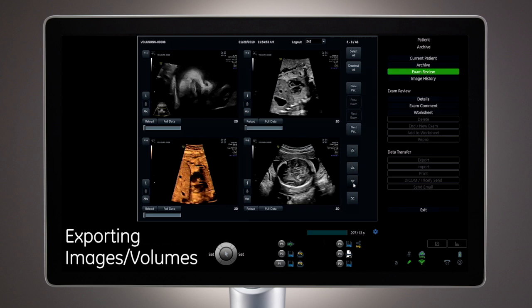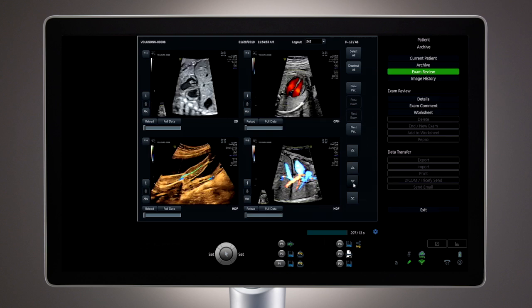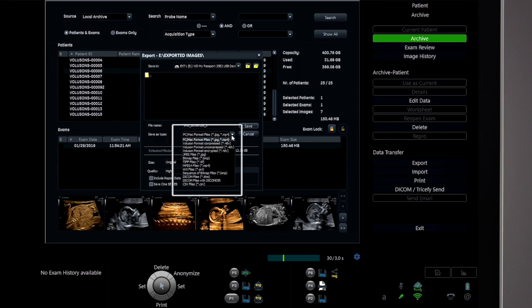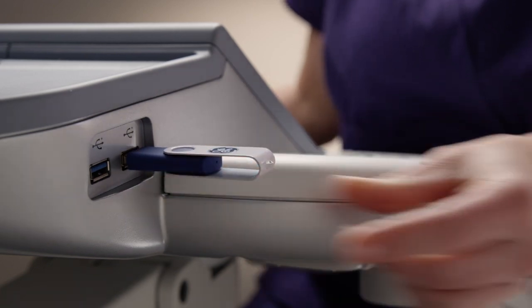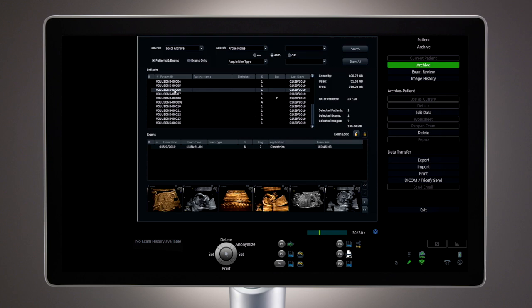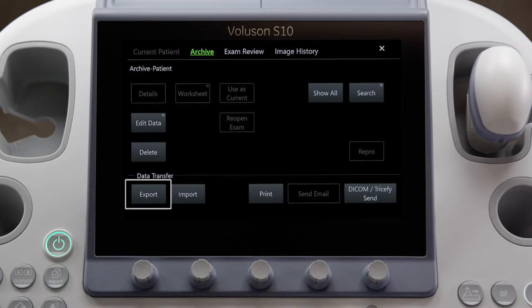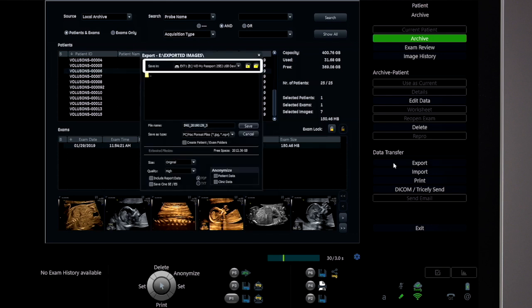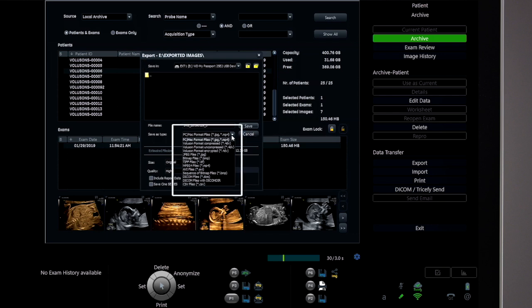Images and data from the archive menu can be easily exported in a variety of formats for longer-term storage or for portability to a CD, DVD, or USB drive. To export exams, select a patient from the list, then choose Export from the display menu or touch panel. A pop-up menu will appear to indicate which media the data is to be exported, along with a variety of choices of export formats.